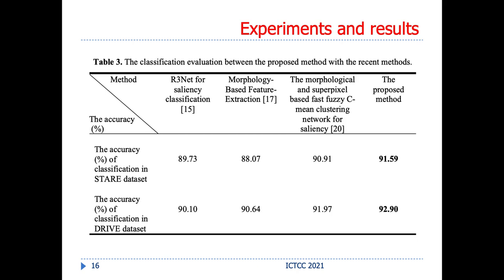From these values, we can see that using the morphology for the inputs of deep learning gives a better result for the classification system. However, depending on the filters or the result for choosing the number of the input parameter, that is also a vital step. The results of the proposed method are better than the others.